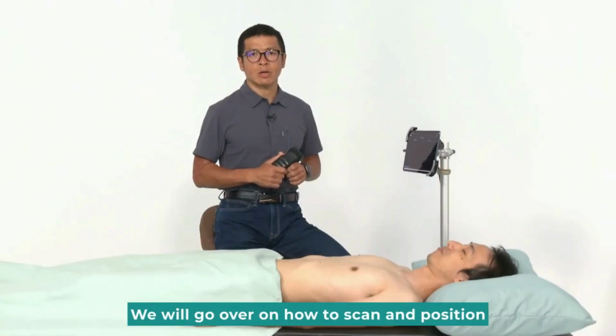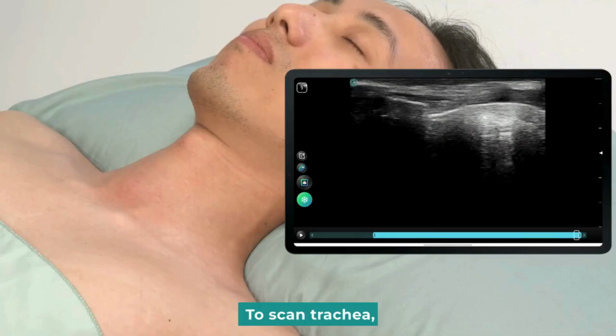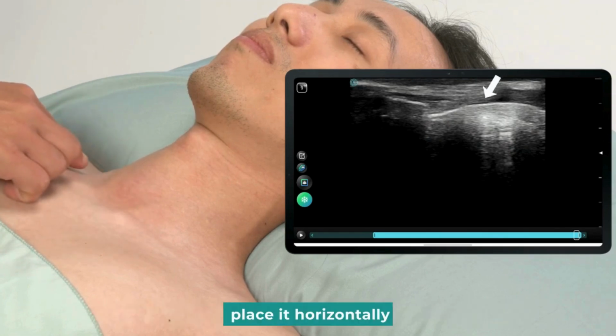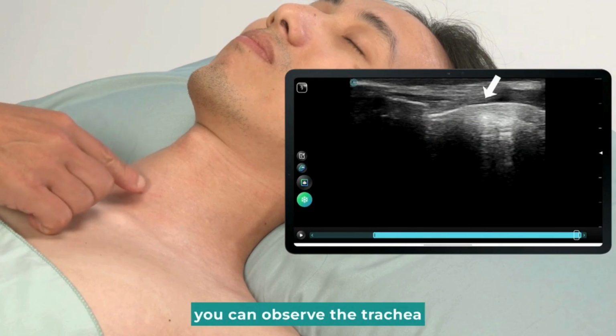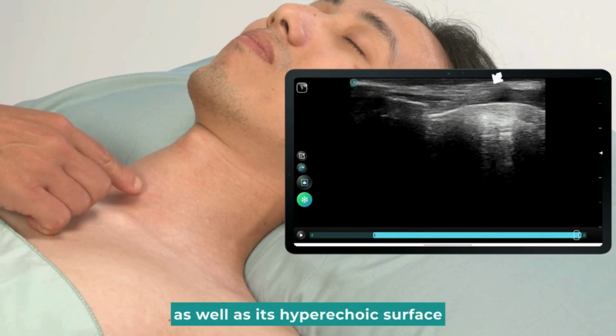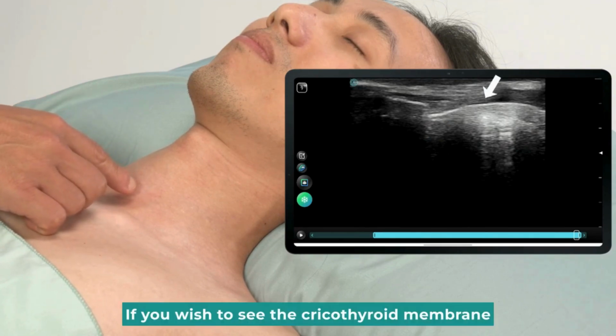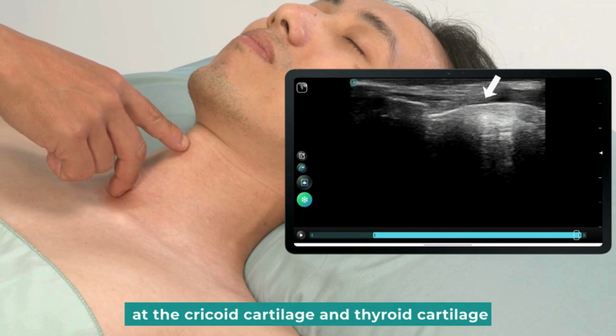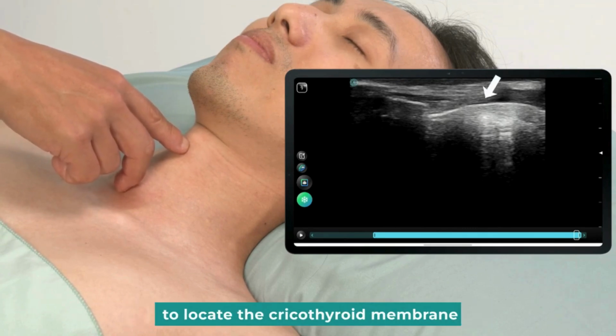We will go over how to scan and position. To scan the trachea, first, we can place the probe at the suprasternal notch. Place it horizontally. You can observe the trachea, as well as its hyperechoic surface. If you wish to see the cricothyroid membrane, we can then place the probe in sagittal view at the cricoid cartilage and thyroid cartilage to locate the cricothyroid membrane.